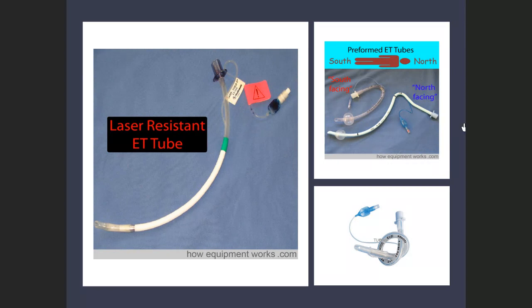I take the point. So, Alison, you now have the difficult question. Did you hear me already tell you it's difficult? It's not really. So we have put these tubes in the mouth. Let's start off with that. The truth is we tend to use the north facing in the nose, through the nose into the larynx. So we've put it in the mouth, Alison, a south facing. So we've put it in the mouth and it's facing down like that.